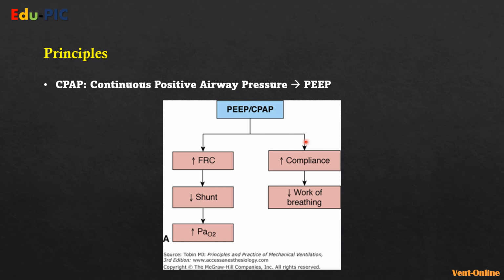You're also adding improvement to the compliance, because if you look again at the curve that we talked about, you're above the inflection point, which means you're getting the best benefit of pressure generated volume, which means that you're going to get less work of breathing.